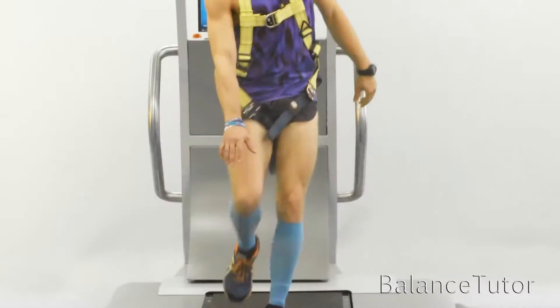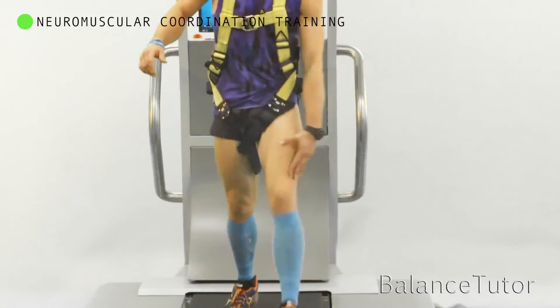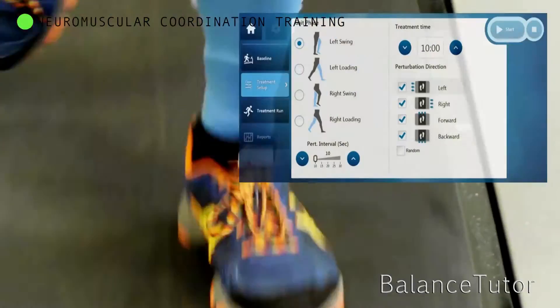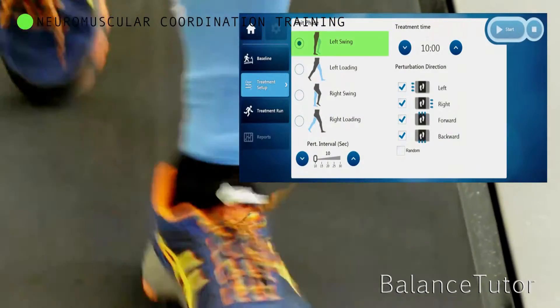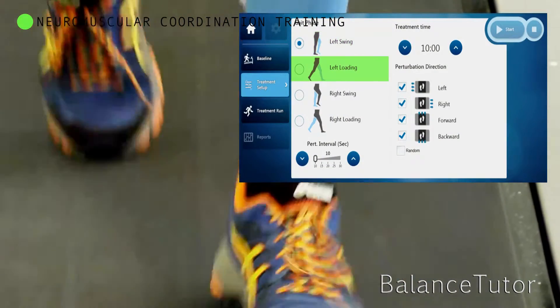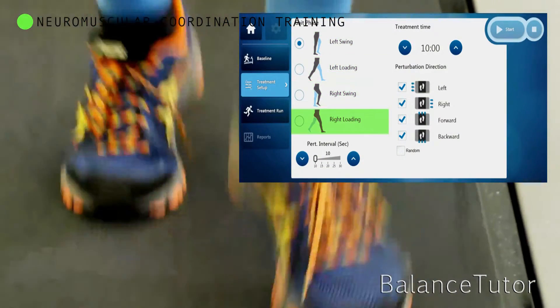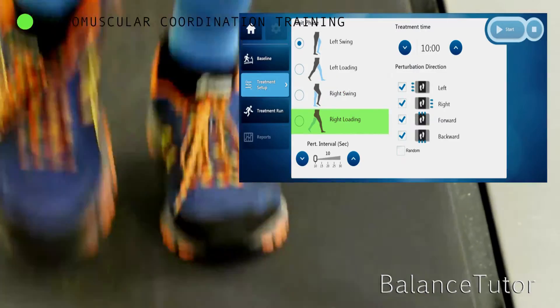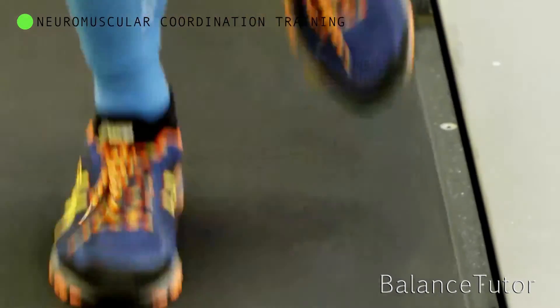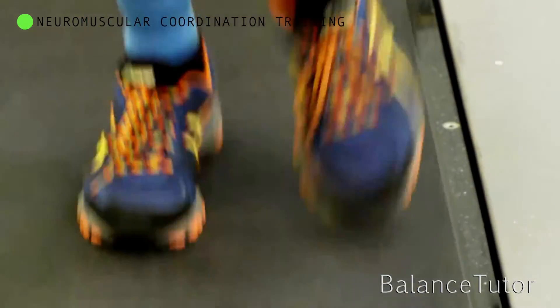This next treatment targets neuromuscular coordination training. Direct perturbations at different phases in the gait cycle allows the therapist to target spacio-temporal coordination as well as force control. This improves neuromuscular coordination.